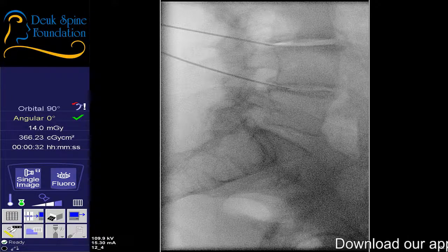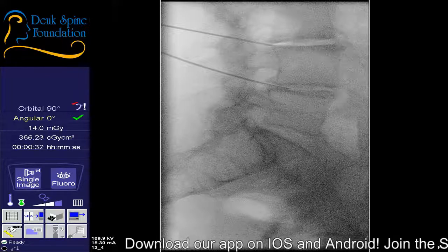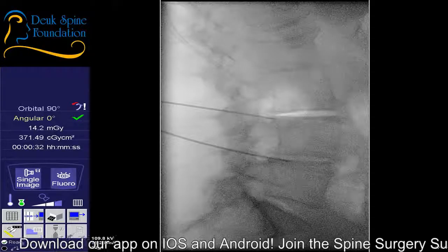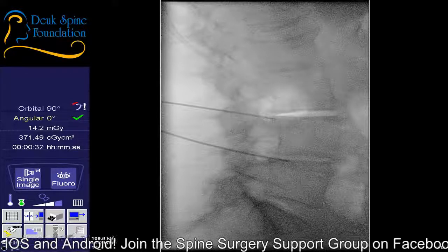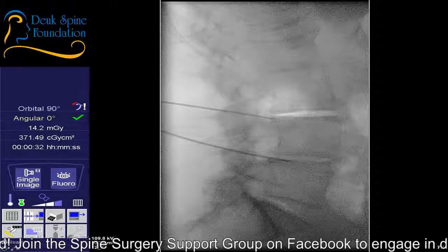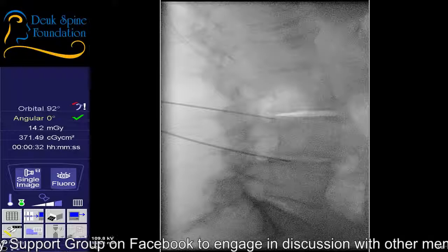You know, we need to see that disc space better. Let's move the fluoro north. More. And let's get a shot. All right. So let's line up that pedicle a little bit better. It's not horrible. And I think Dr. Santiago's suggestion of a little bit of rotation this way may be in need, but no more than a degree or two. Shot, let's see where we are.